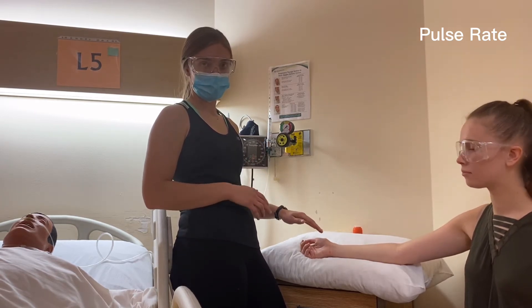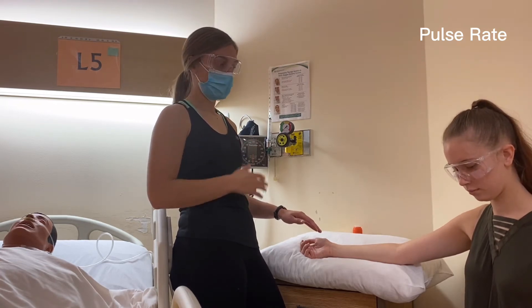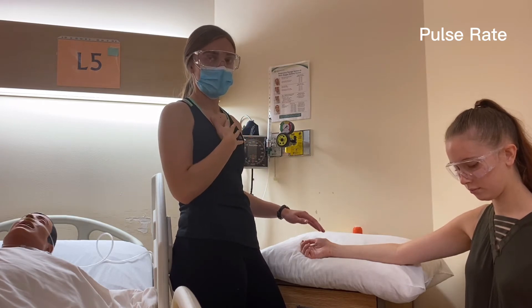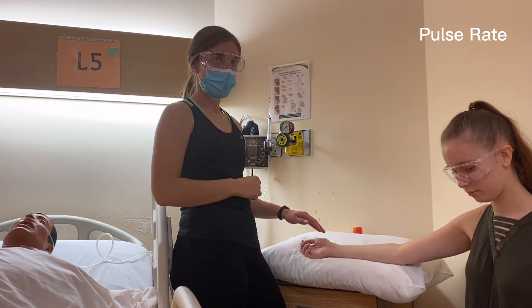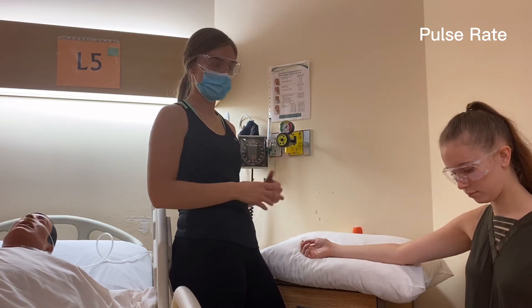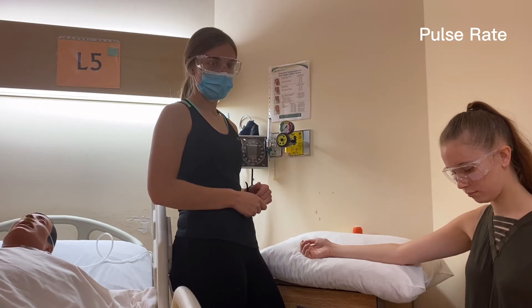After doing the pulse — whether it's the 30 seconds or the 60 seconds — we're going to measure the respiratory rate. That'll just be watching the person breathing up and down to count it, so they don't know they're being watched and their breathing isn't affected. That can be done directly after you do the pulse.